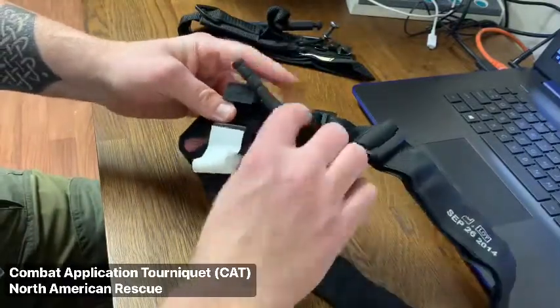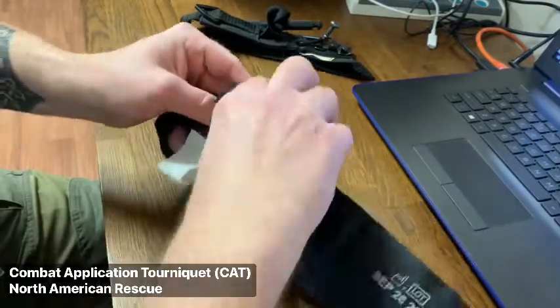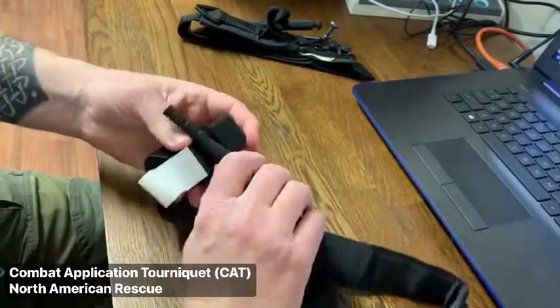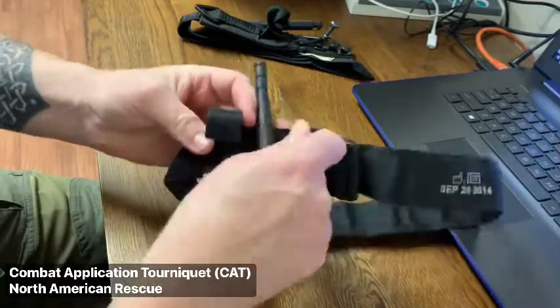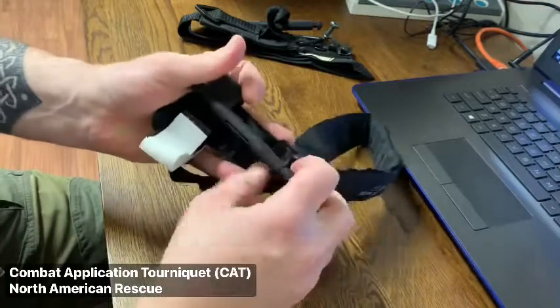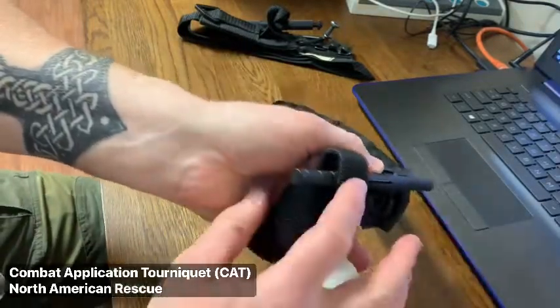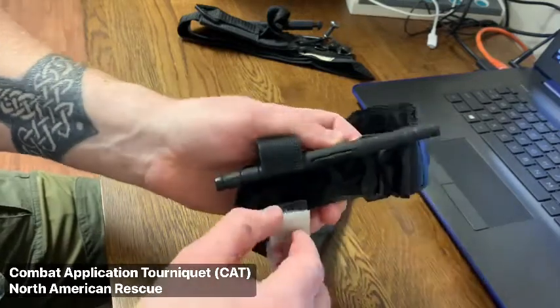The windlass rod is made of a strong plastic material that is resistant to cracking and breaking. Once you rotate the windlass until the bleeding has stopped, you can secure the windlass within either of the two windlass clips. Finally, you can use the attached windlass strap to further secure the windlass, and annotate the time of the tourniquet application if you desire.